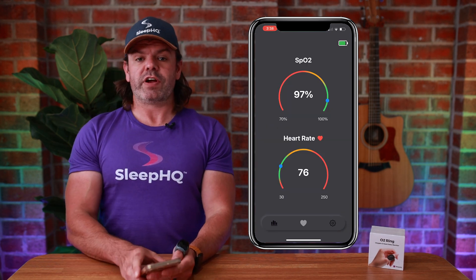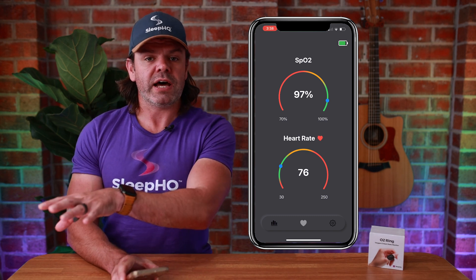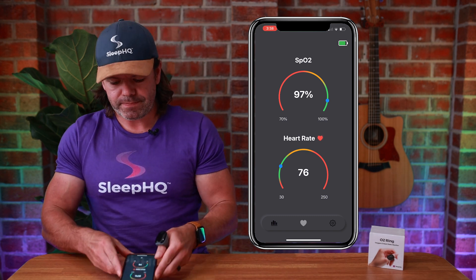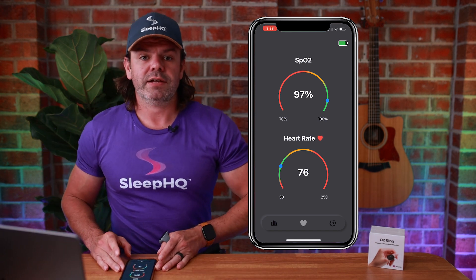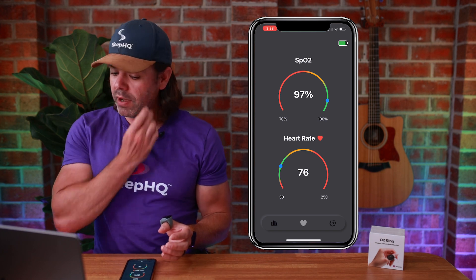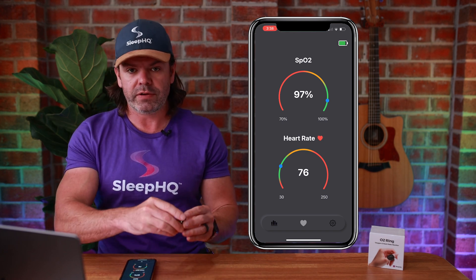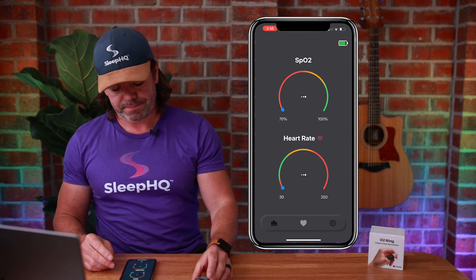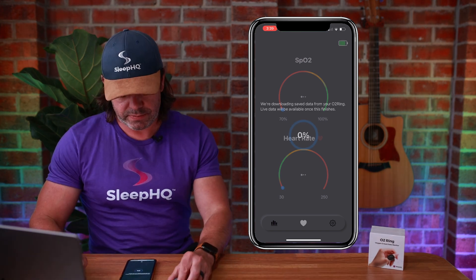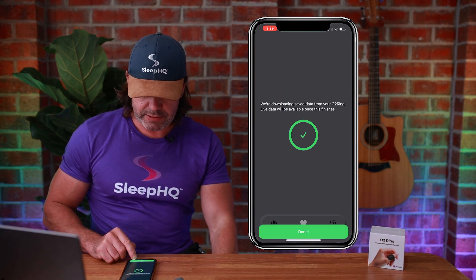Let's do a live demonstration now. With my Sleep HQ profile open on the data import section, I'm going to take off the ring and you'll see the data automatically appear in my account. The moment of truth — take off the ring, and it does a little countdown. We're syncing now — downloading saved data — and done.